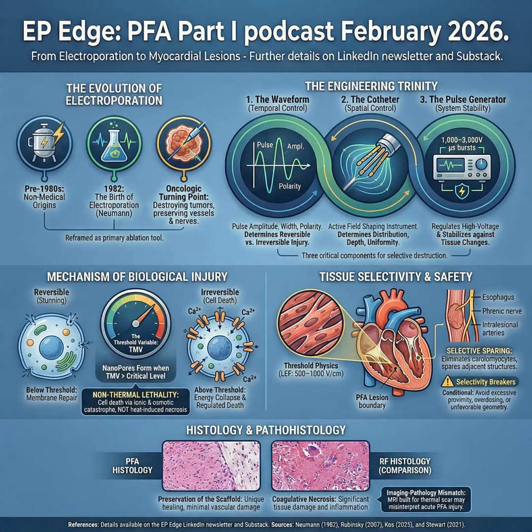Here's the structure. Part 1, this episode, is foundational. We're going to build the mental model: what electroporation is, where it came from, and why PFA is not just, as touted, RF without heat. We'll talk history, engineering, biology, tissue selectivity, and what lesions actually look like under the microscope.